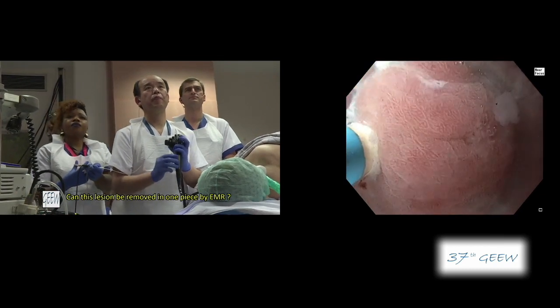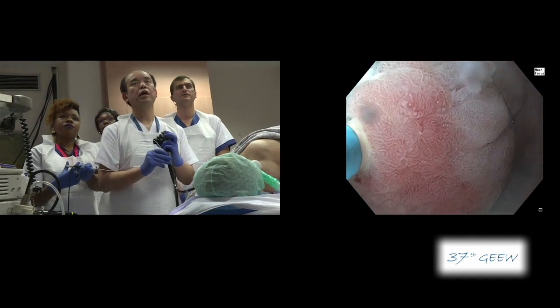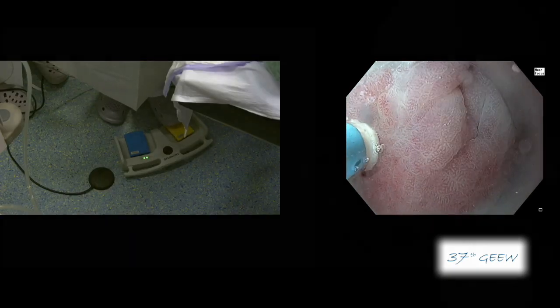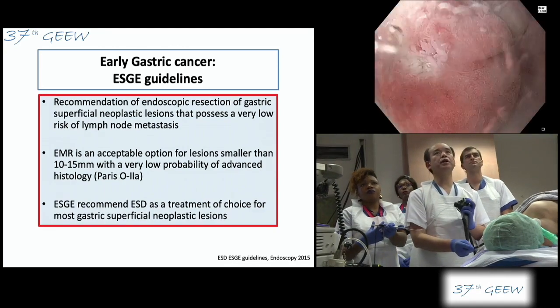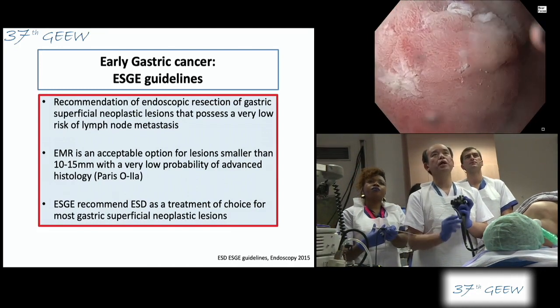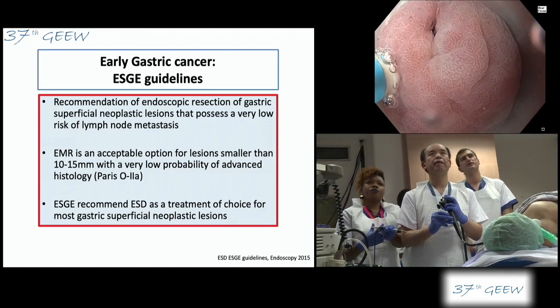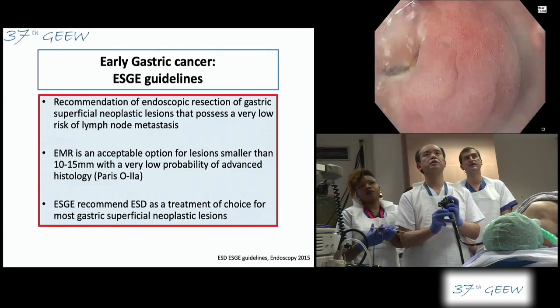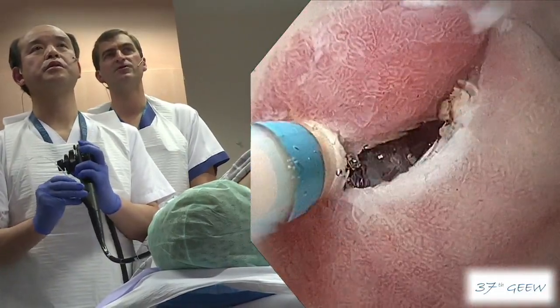There is a question from the audience: can this lesion be removed in one piece by EMR? Yes, because of the small size, if we use a big cap, one-piece resection would probably be possible even with EMR. But sometimes the snare wire slips out from the target region. Therefore I prefer to do ESD even for small lesions, because it is more precise. With cap EMR you have no control of the margin — you see the target before and then hope it will be in the snare at the end, but you have no control of what you do. This is the main advantage of ESD for small lesions.